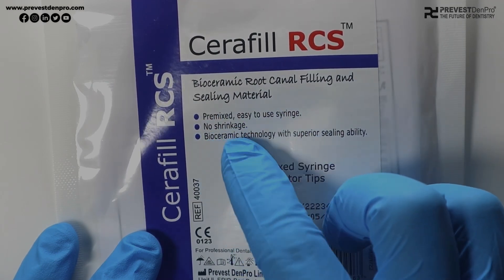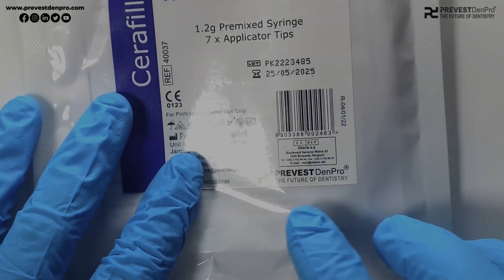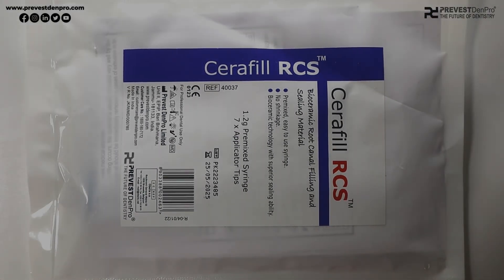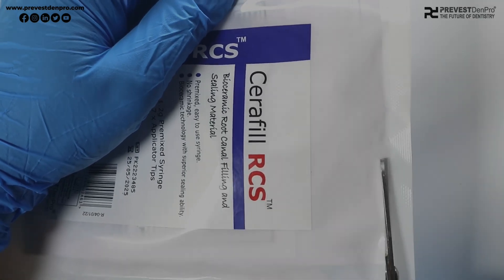It comes in pre-mixed syringes and was developed with superior sealing ability in a 1.2 gram pre-mixed syringe by DENPRO. Let's open up the packaging and see what are the contents inside.